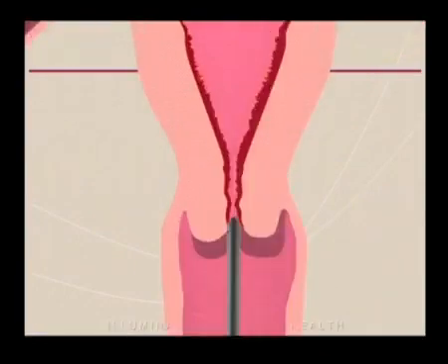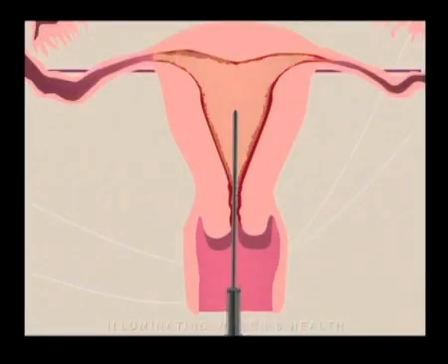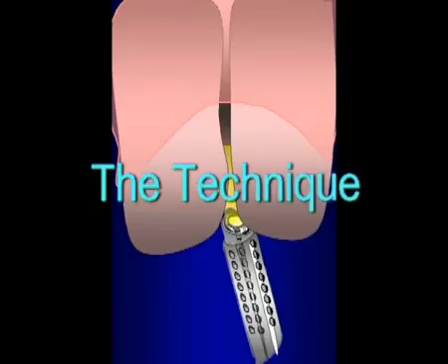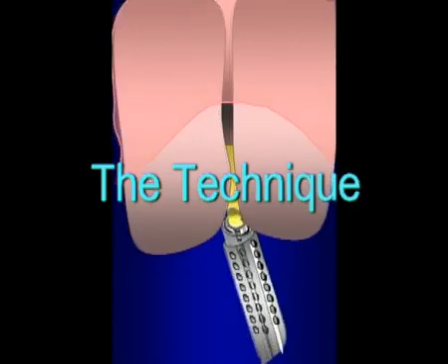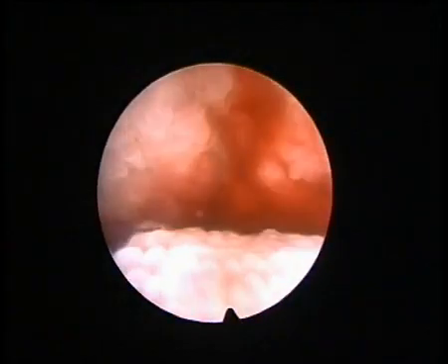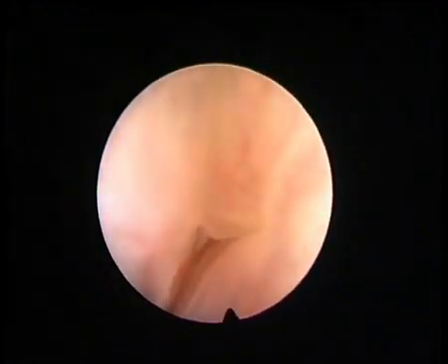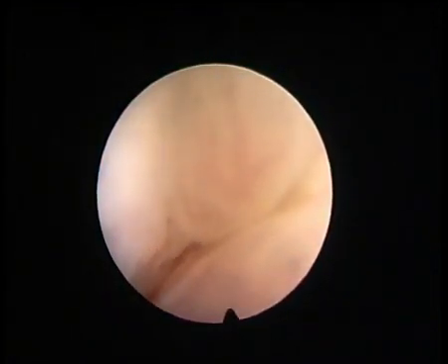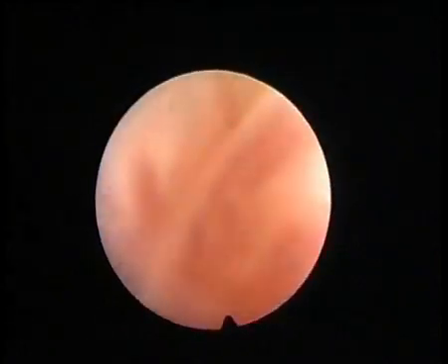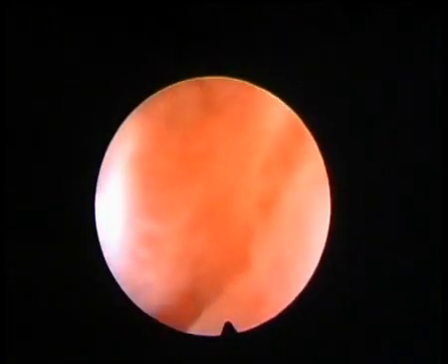The standard anaesthesia regimen for outpatient hysteroscopy in our unit includes prescription of non-steroidal anti-inflammatory drugs the night before and 1 hour prior to the procedure, as well as intraoperative transcervical lignocaine. To minimise pain at outpatient hysteroscopy, gentle tissue handling and avoidance of unnecessary steps are essential. A speculum is inserted into the vagina to facilitate the transcervical block and is then removed. Instrumentation of the cervix with vulsellum or tenaculum and dilatation of the cervix is not performed unless absolutely necessary, for example in the case of significant cervical stenosis.